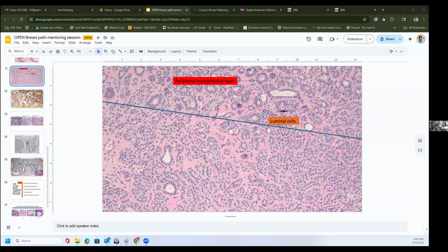So I have one actually. It's on slide number 12 of your presentation. It's on the IC staining. I mean, it's just very basic. So, the staining loss seems to be dramatic in the lower part compared to the upper one when you were delineating the 2 different zones. As a novice, how would you distinguish whether the loss is due to actual loss of the marker that you're studying, or is it due to an error during the staining process, like when you were cover slipping?